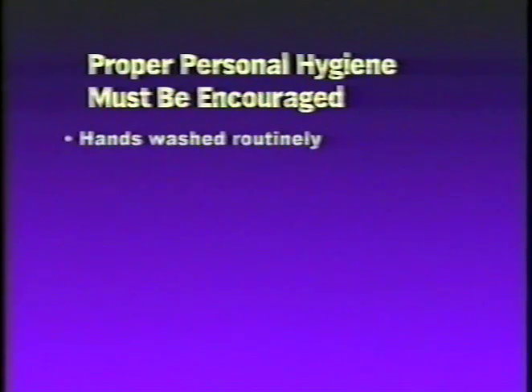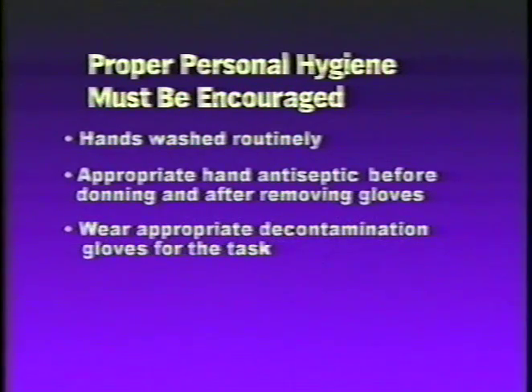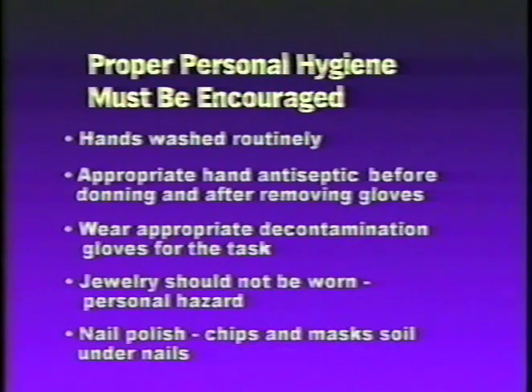Hands should be washed routinely, utilizing an appropriate skin antiseptic before donning and after removing gloves. Gloves of a proper thickness should be worn when handling contaminated devices and when removing them from the washer to avoid skin punctures. Jewelry should not be permitted. Jewelry could become caught on items being cleaned and cause injury to the personnel wearing them. Nail polish should not be worn since it could not only chip and fall into cleansed devices, but it could also mask harmful soil underneath nails.